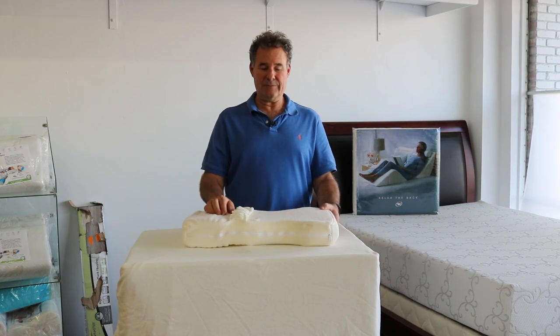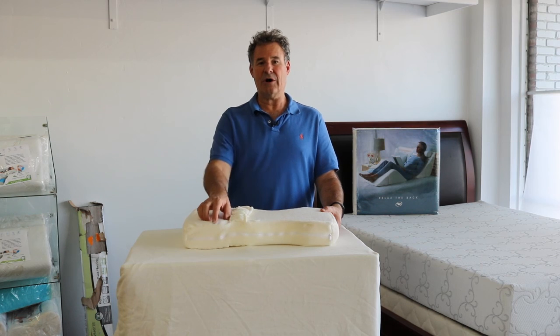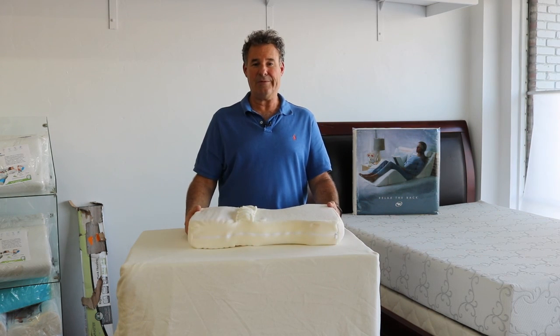It comes with two straps to secure it to the leg, and ribs on the end for the ankles for a proper fit.